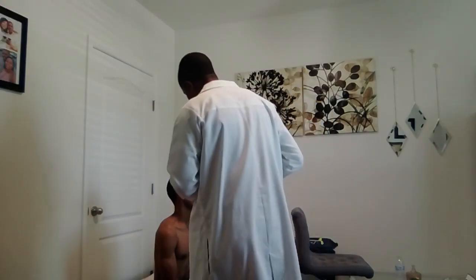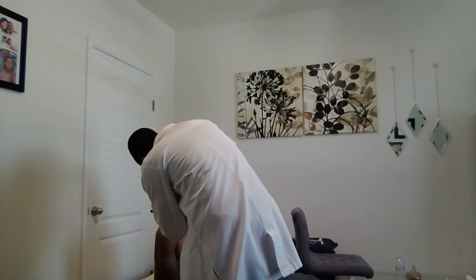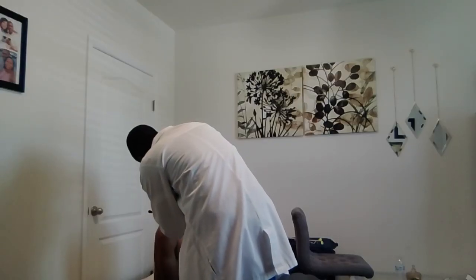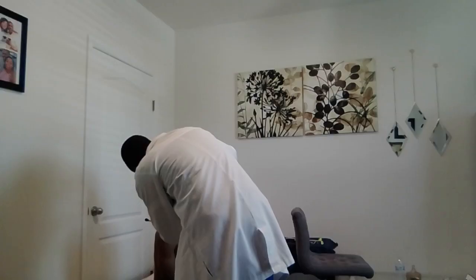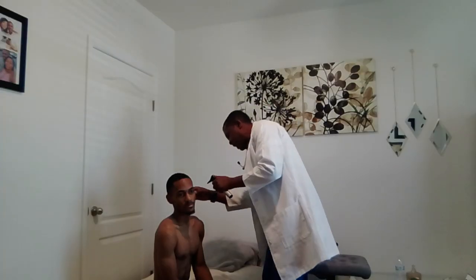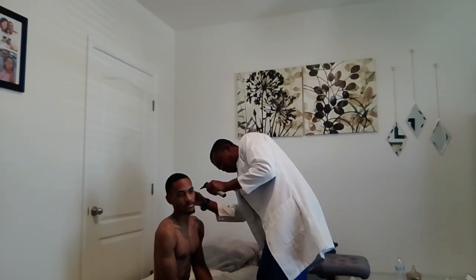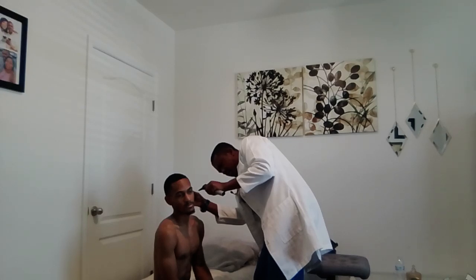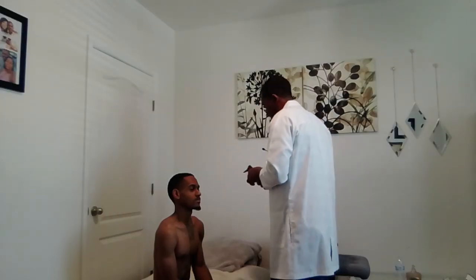Okay, I'm going to shine the light. I'm going to pull it up and back. Okay, I can see there is no drainage. I can see the bony landmark, tympanic membrane, gray looking color. There is no lesion, no erythema, normal. Okay, the same thing for this side. I'm going to pull it up and back. No drainage, no erythema, bony landmark is present. Tympanic membrane is gray looking color. Excellent. Everything okay so far, Frank?